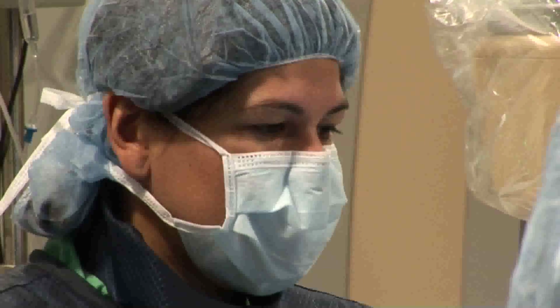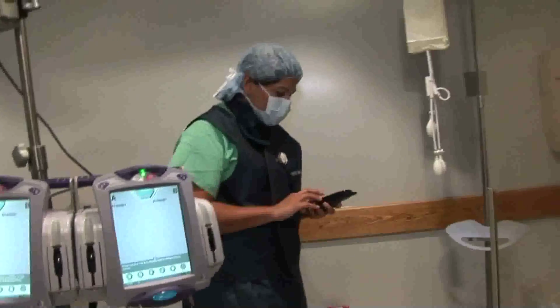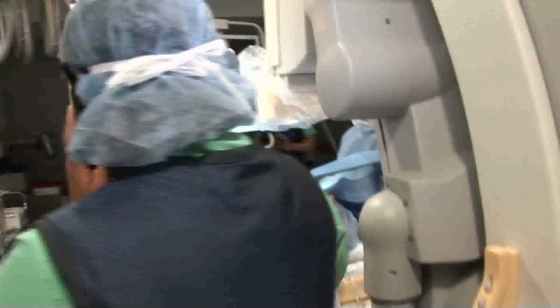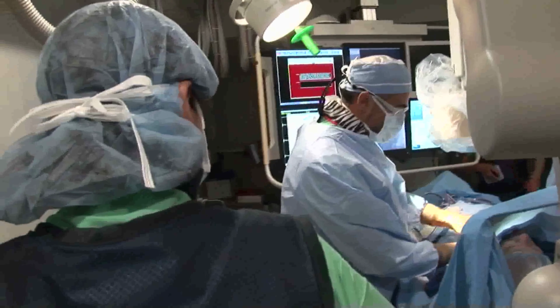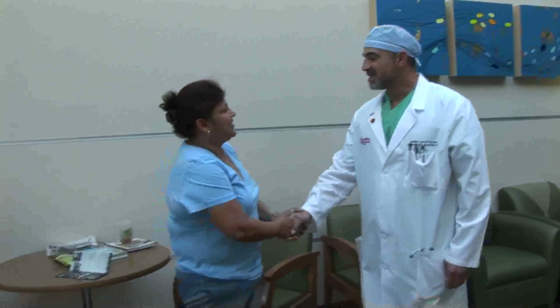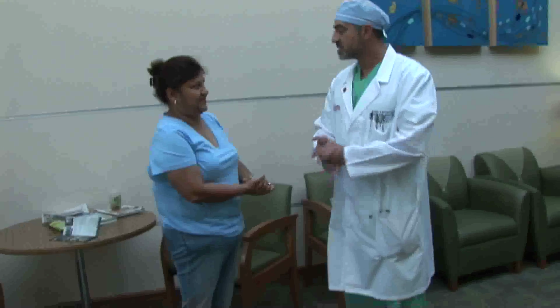Throughout the procedure, a nurse is constantly at the patient's side, monitoring vital signs, administering sedation as needed, ensuring patient safety and comfort, and periodically updating the family by phone. After completion of the procedure, the physician meets with the family in the waiting room to inform them that the procedure is over and to answer any questions.